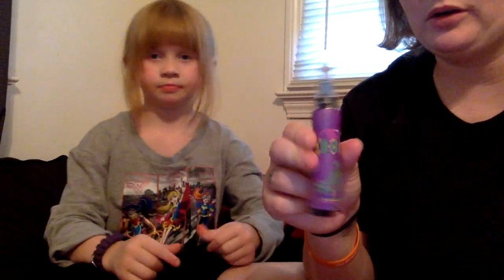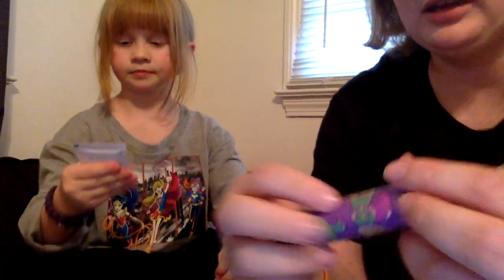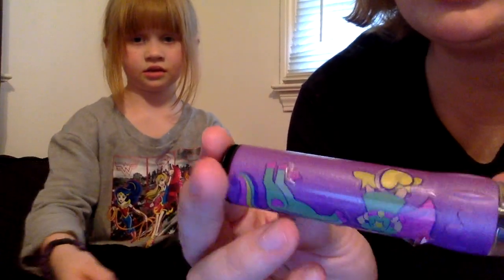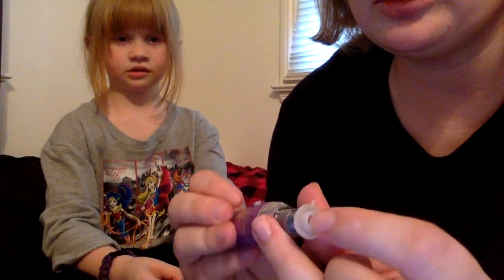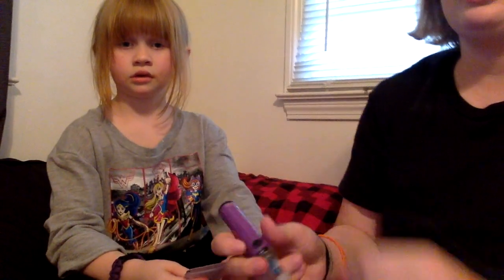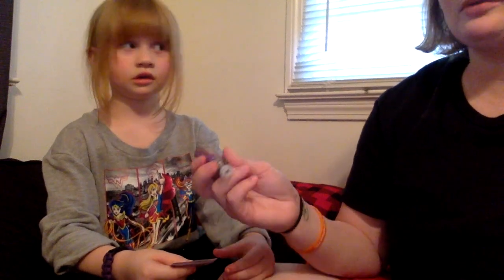This is her poker, as she calls it, but it's a genteel lancing device, and it's made so she can prick her finger, her hand, her arm, her leg, just makes life a little bit easier for her. Go ahead. It doesn't work on my leg. It does, you just don't like to do it on your leg.